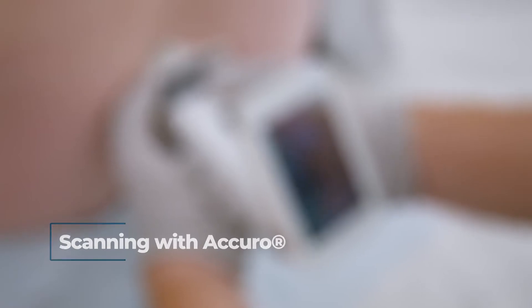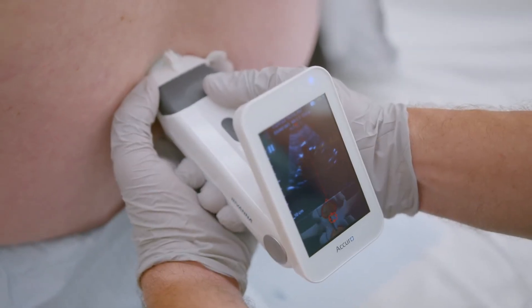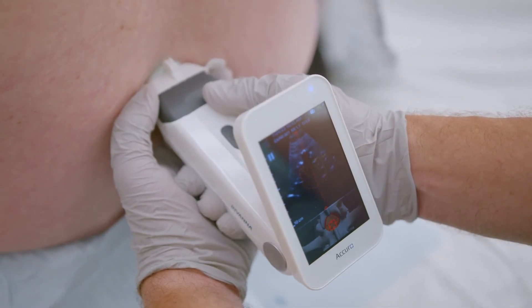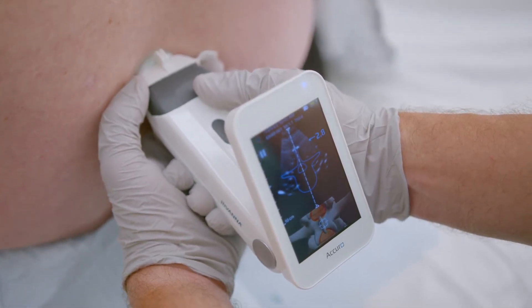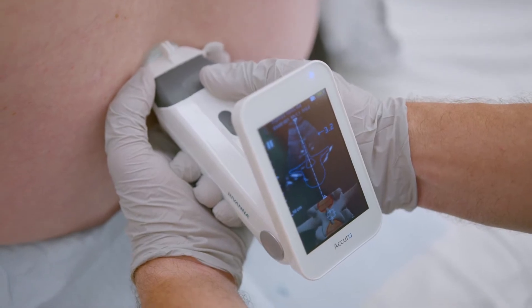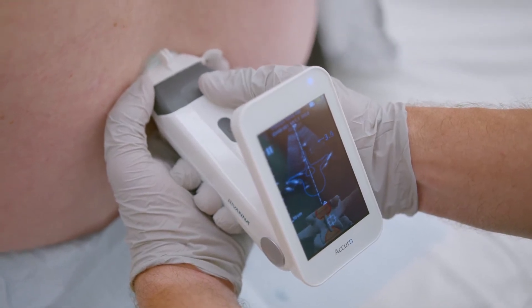Scanning with Acuro. Scan with dominant hand under the Acuro. Scan slowly, horizontally. Micro-movements are best. Scan with the same trajectory you typically use for injections.